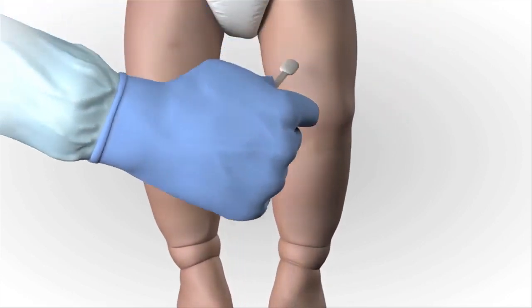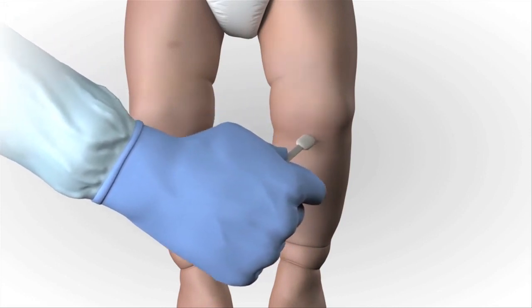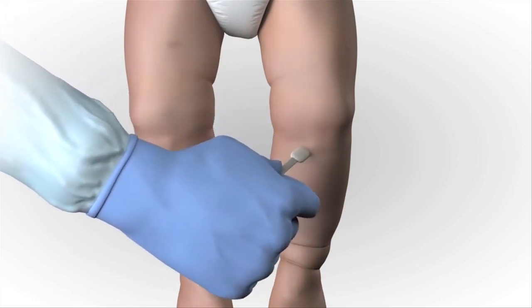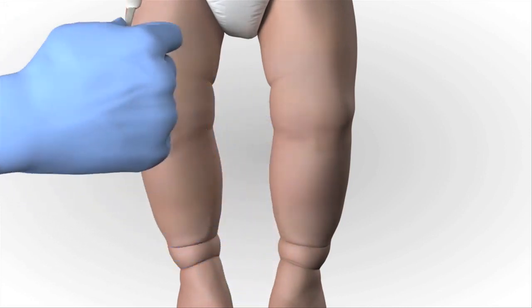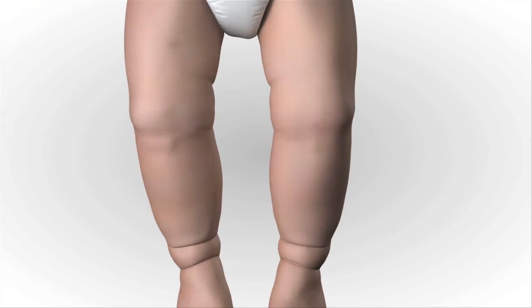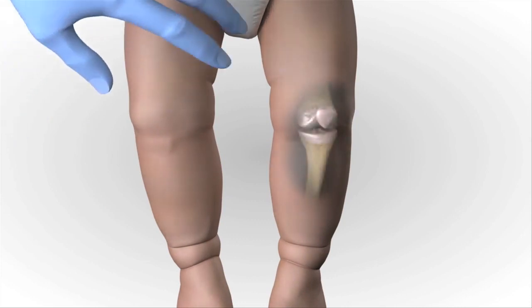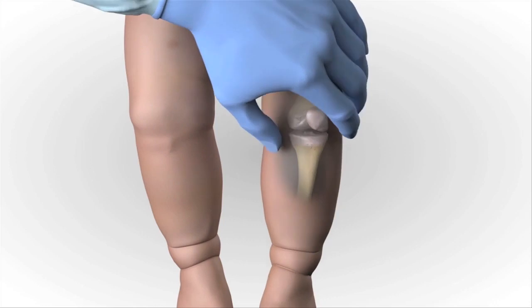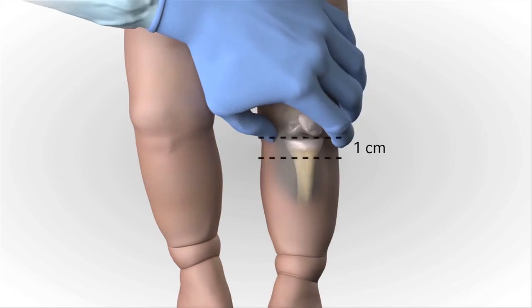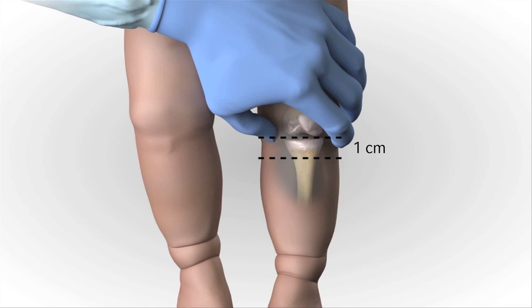Extend the leg. Prepare the site by using antiseptic of your choice. Use a clean, no-touch technique. The insertion site is approximately 1 cm medial to the tibial tuberosity, or just below the patella, approximately 1 cm and slightly medial.